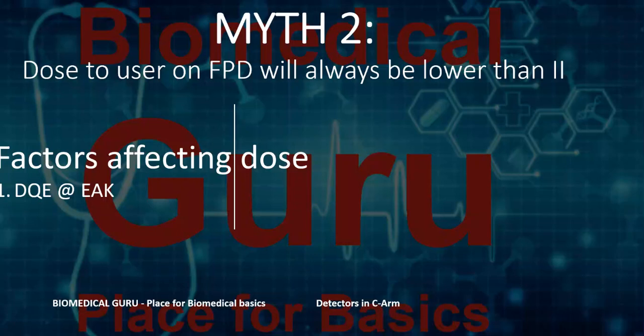Some detectors are made more efficient at low energy. Some detectors are made more efficient at higher energy. Just like some vehicles are designed to give more mileage if you ride in the city, and some vehicles are designed to give more mileage when you ride above 100 kilometers per hour. A similar analogy will apply even for DQE. So a high DQE machine does not mean high DQE at every possible energy level. It is high DQE at a particular energy level. Next is the inherent filtration. So what is the total filtration on the machine?